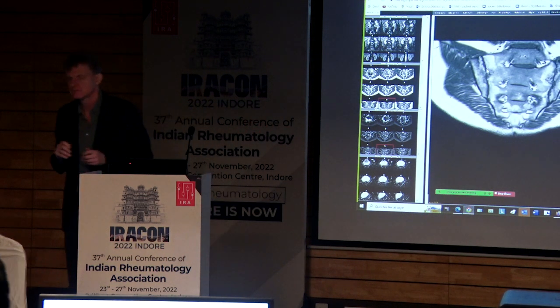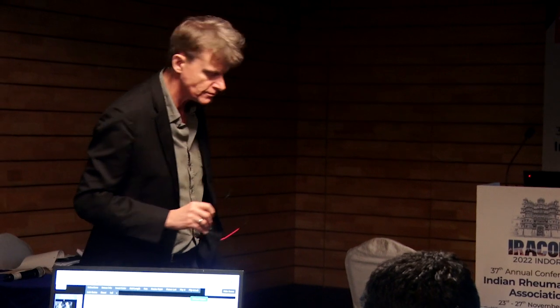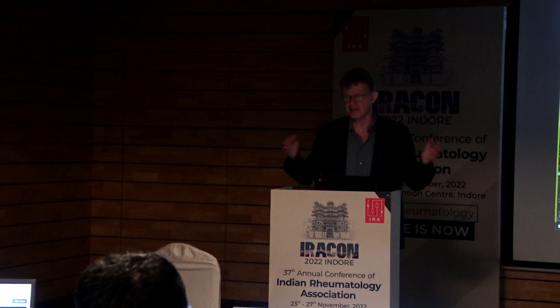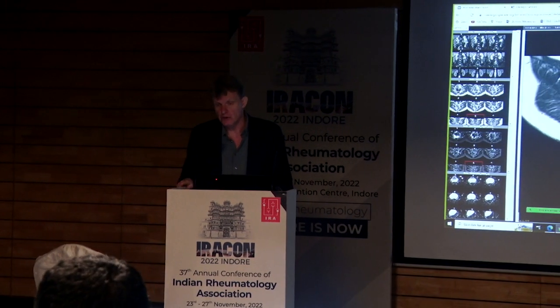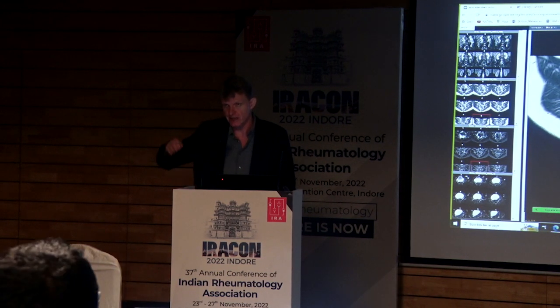Yes? In routine clinical practice, how frequently do you repeat the MRI? Is it every 3 years or 5 years or what? Yes. The question is, in my clinical practice, how frequently do I repeat my MRIs? Every 3 years, every 5 years, that's what you said. In reality, we don't do it in clinical practice at any regular interval.